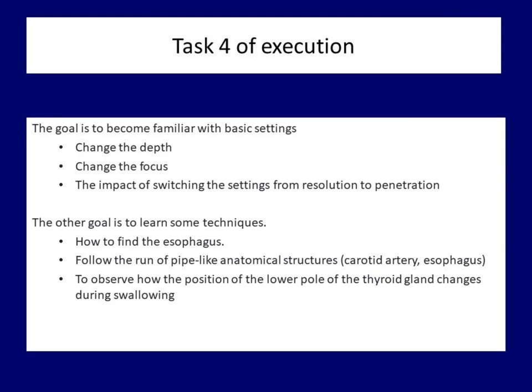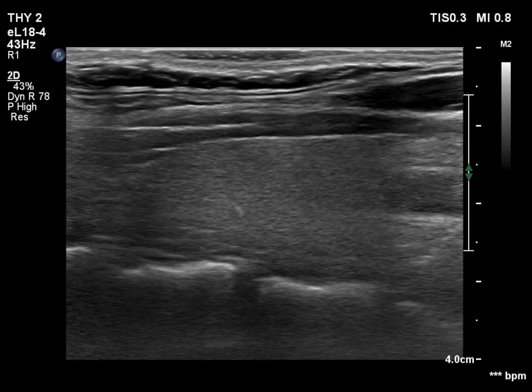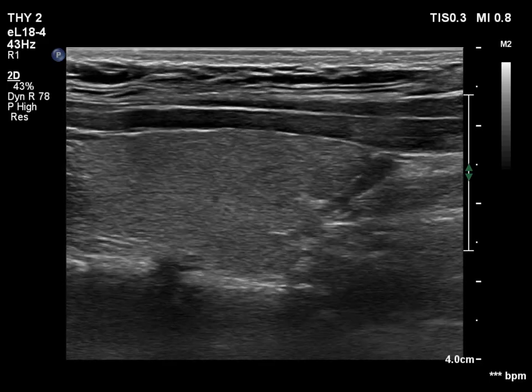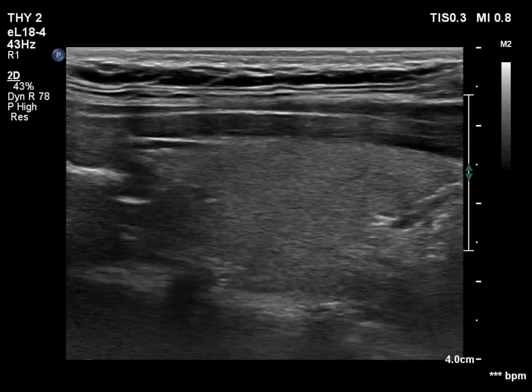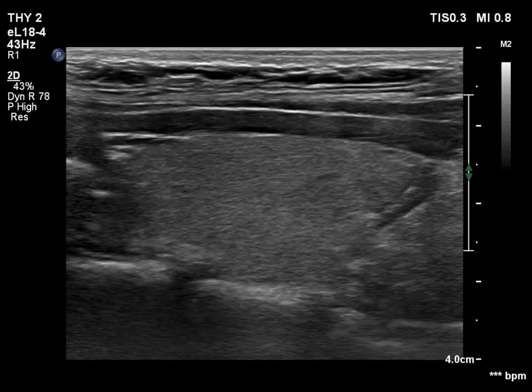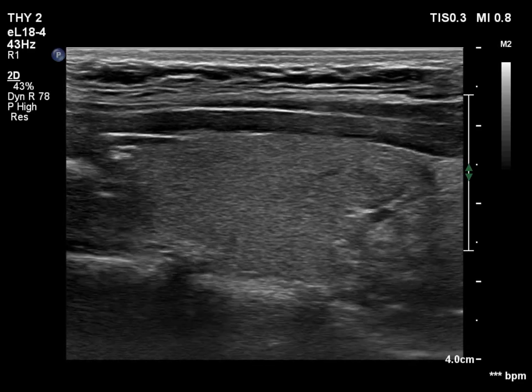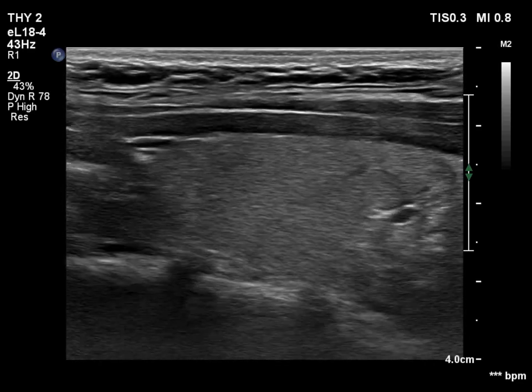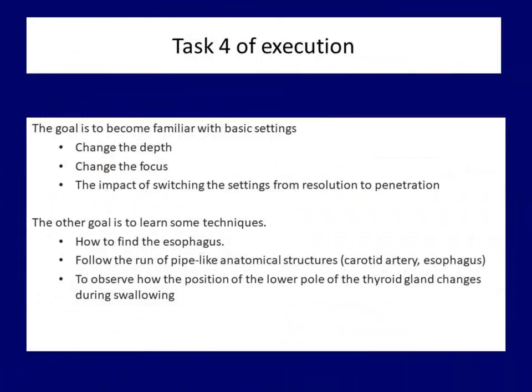Now the lower pole is demonstrated in normal position. We ask the patient to swallow — the thyroid moves upward during swallowing and thereafter moves back to its normal place. That's the end of it and you are done. If you can do these four steps safely, you will thrive on your own from now on.